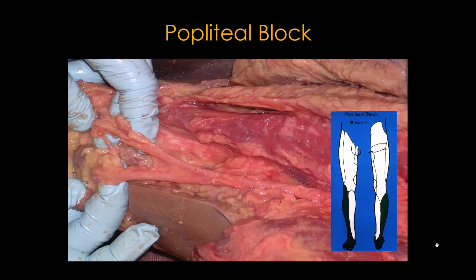So this is a great representation of the paraneurium right here. So you have the two nerves wrapped in the paraneurium. And you have popliteal fossa down here, that's like your knee. And then as you go up higher, you're gonna have to pick a spot where to block it. Now, way up here, you're not gonna be able to get in between the two. And way down here, the nerves are too spread out. So you wanna find right when they bifurcate, go through the paraneurium, and think of it as a pair of pants. So common peroneal, posterior tibial. Even if I inject a little bit on my left leg, it's gonna spread up and go over and go down the other nerve. So it's like a sock, like a sheet, spread's gonna go up and down.